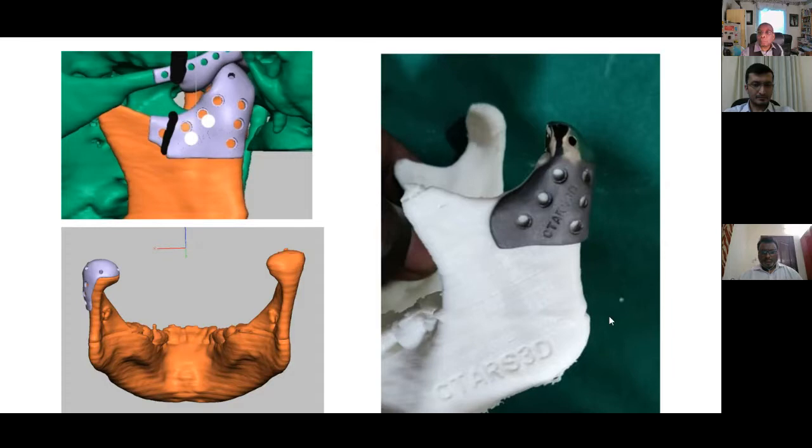And this is published, and this particular case is published as the GD condylar cap process. It's a half of the condylar head, capped with a lateral extension.